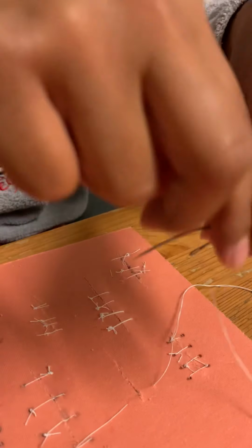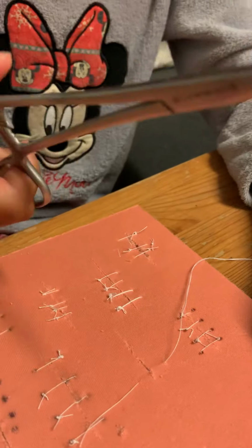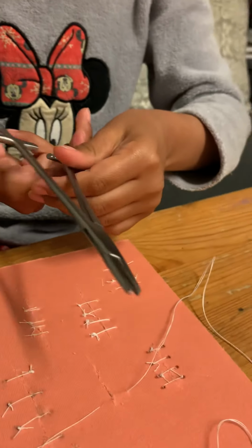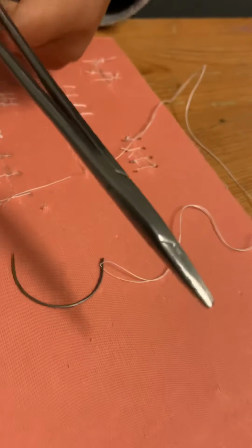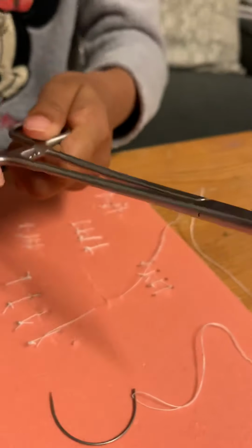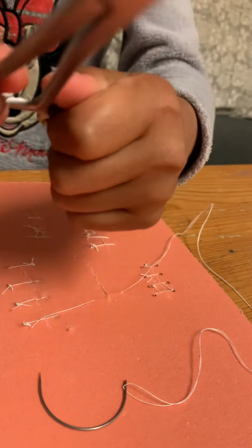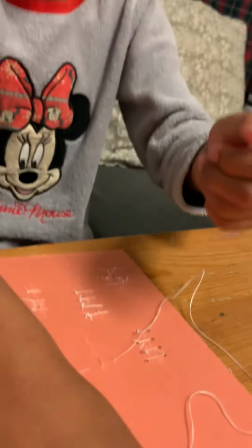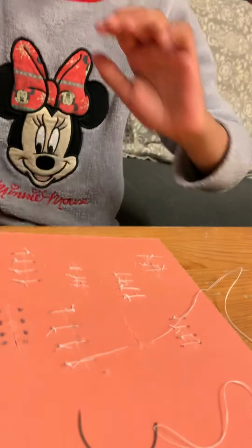Okay, so now that we've done that, we can put this thing down and we take these special scissors. They don't cut, they snip and hold. And you can also close them and open them up. And if you don't know how to open them up, like me at first, you just snip them back. So like my hands are like this, you go like that. So now let's go back to the stitch.